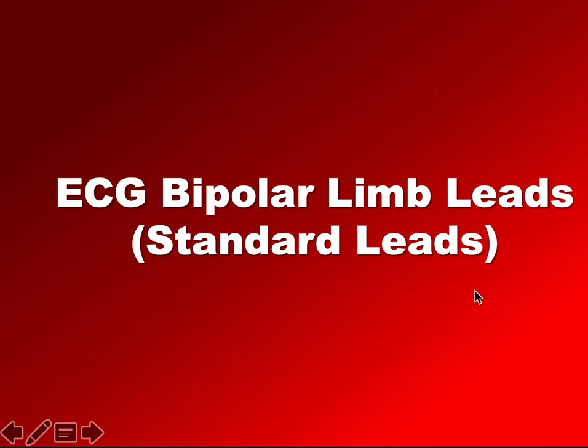Thus, a bipolar lead is not a single wire connecting from the body, but a combination of two wires, and their electrodes are placed on the limbs and they record the electrical activity of the heart. So, today we'll learn what bipolar limb leads are, how they are placed, and why they are called standard limb leads.